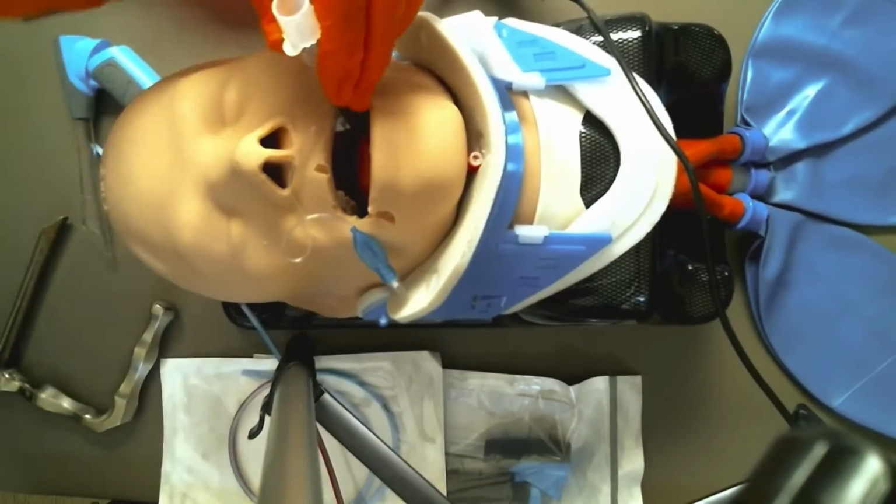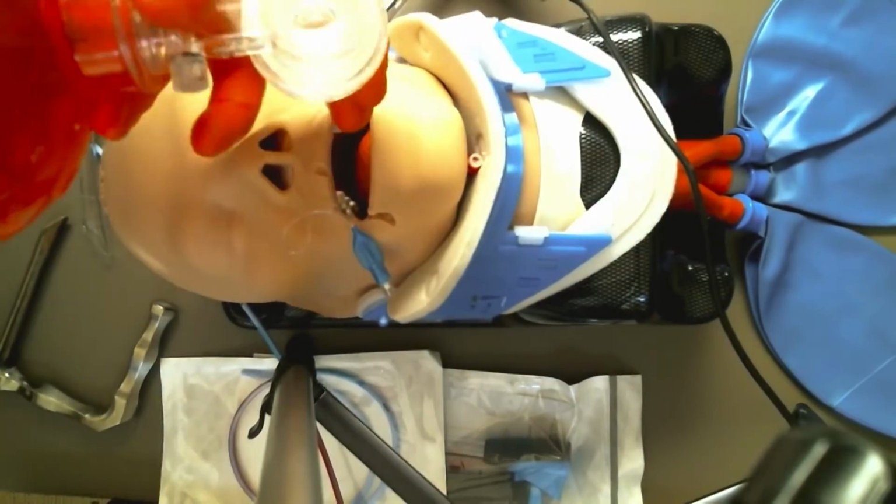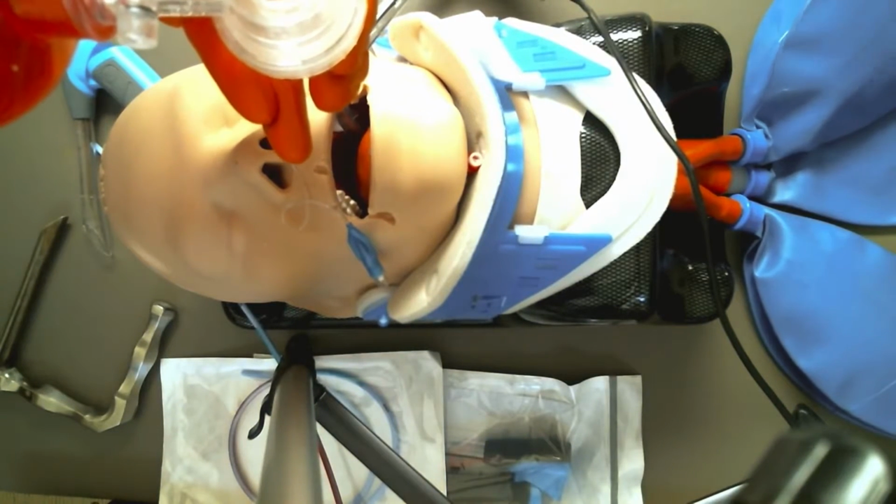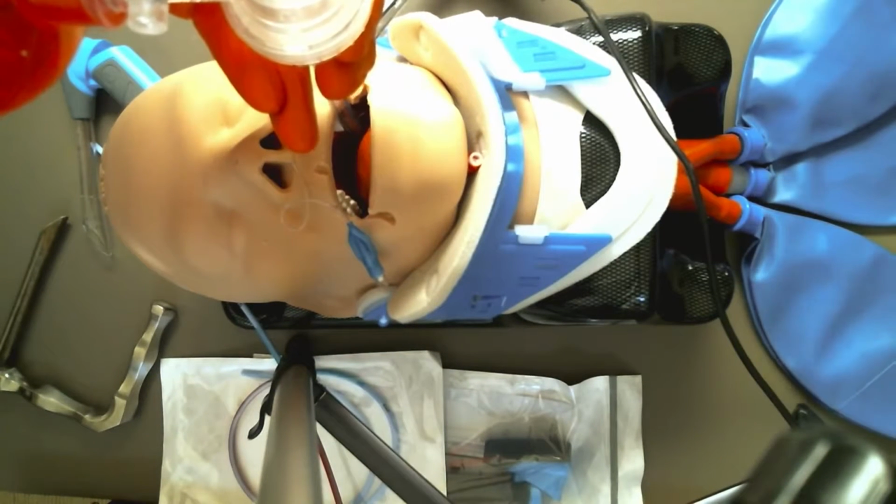Inflate the cuff, ventilate your patient. Check for bilateral breath sounds, check the capnography. Now a quick look from the inside.